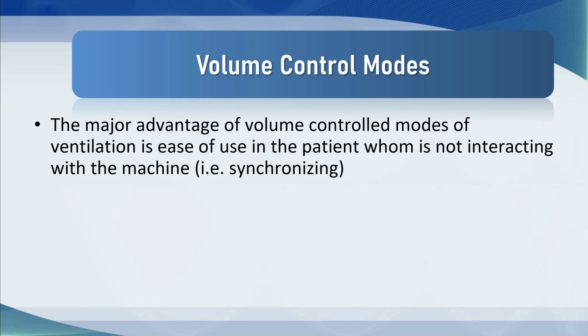And you can be confident on these modes that the patient will receive the desired minute ventilation to ensure both oxygenation, as evidenced by the PaO2 or the oxygen saturation, and ventilation, which is evidenced by the pH and the PaCO2, are within the range that you desire.